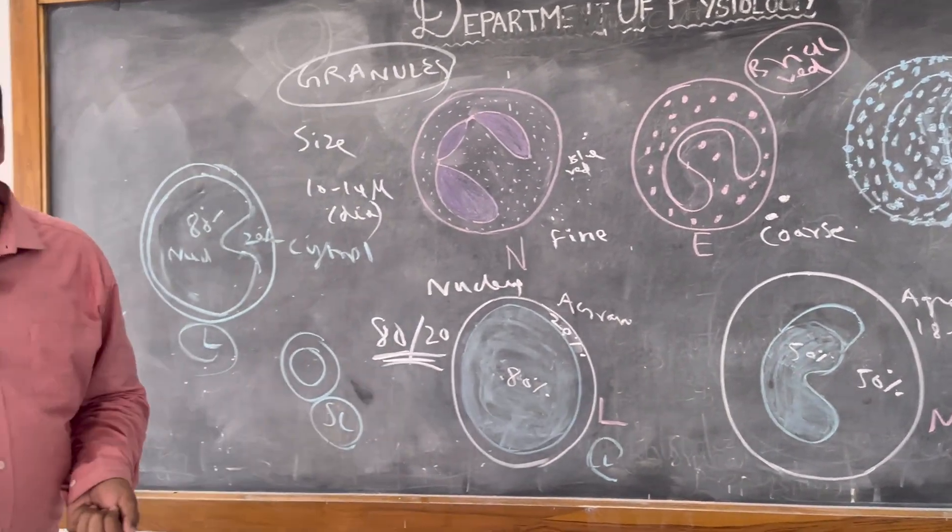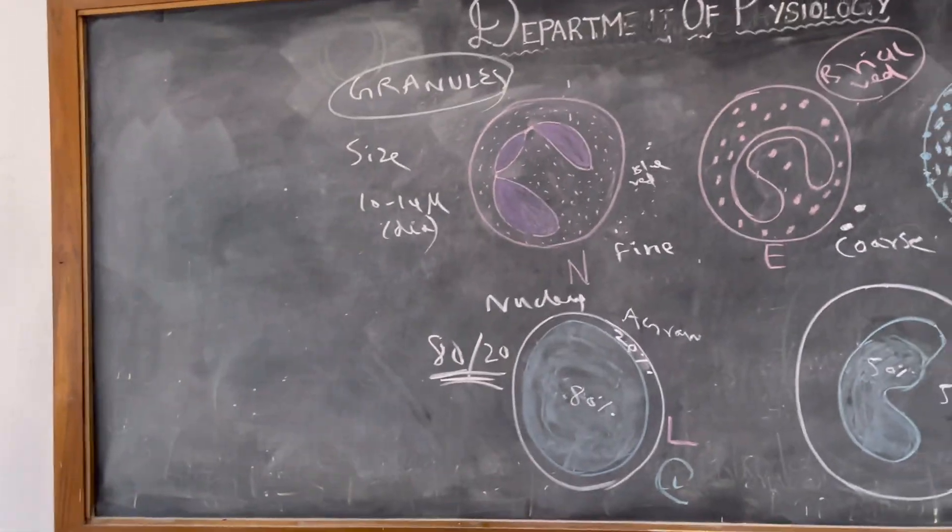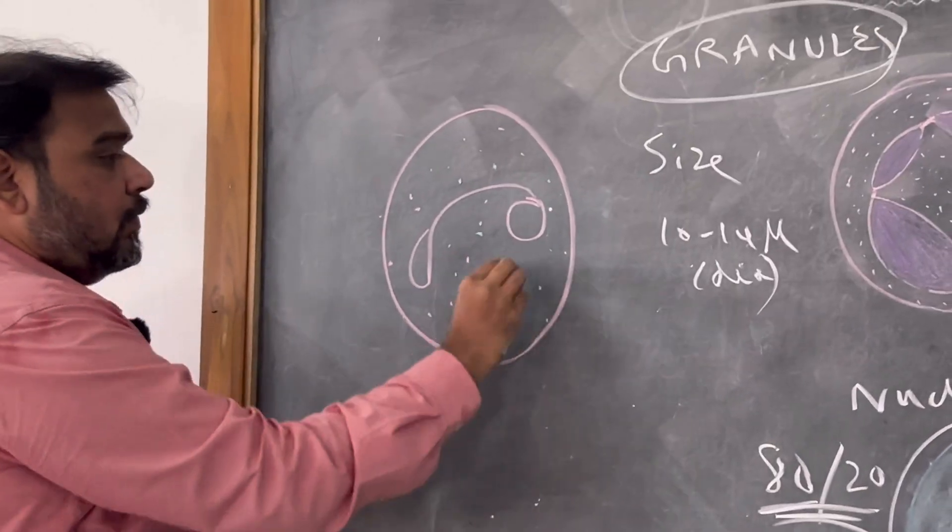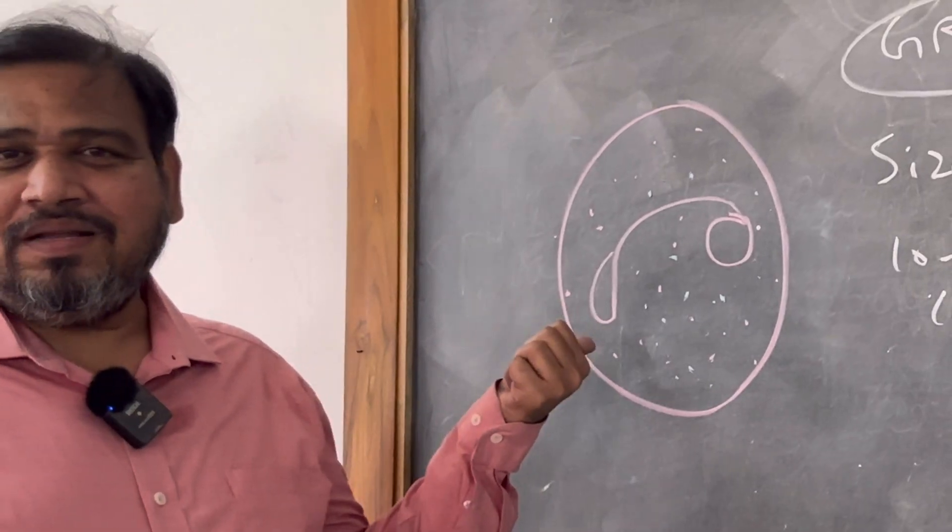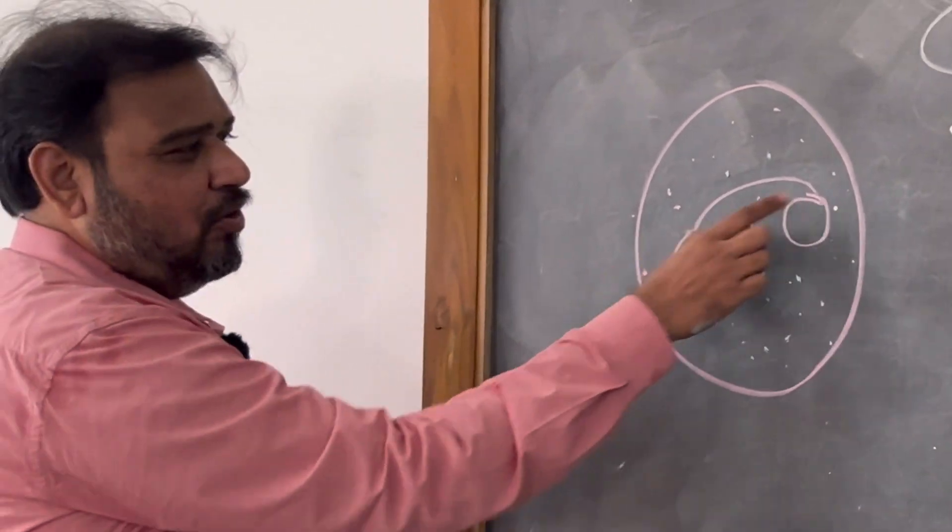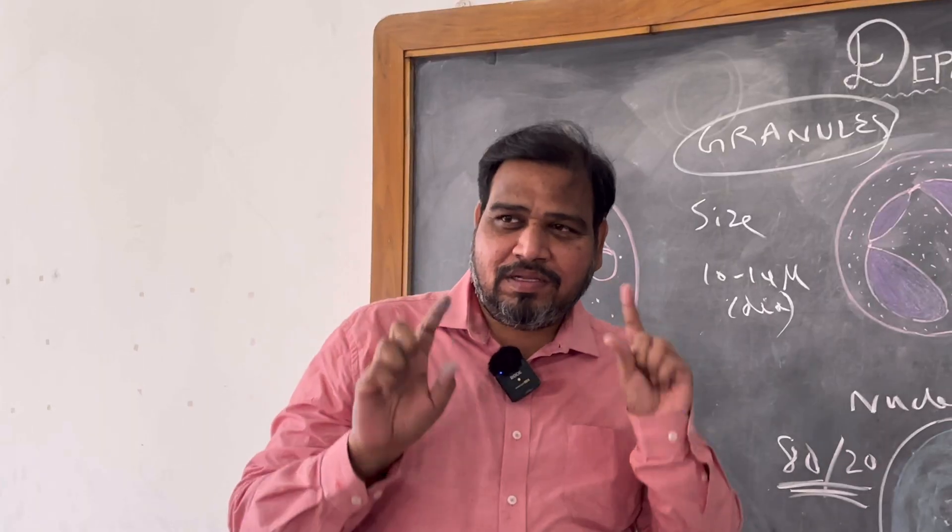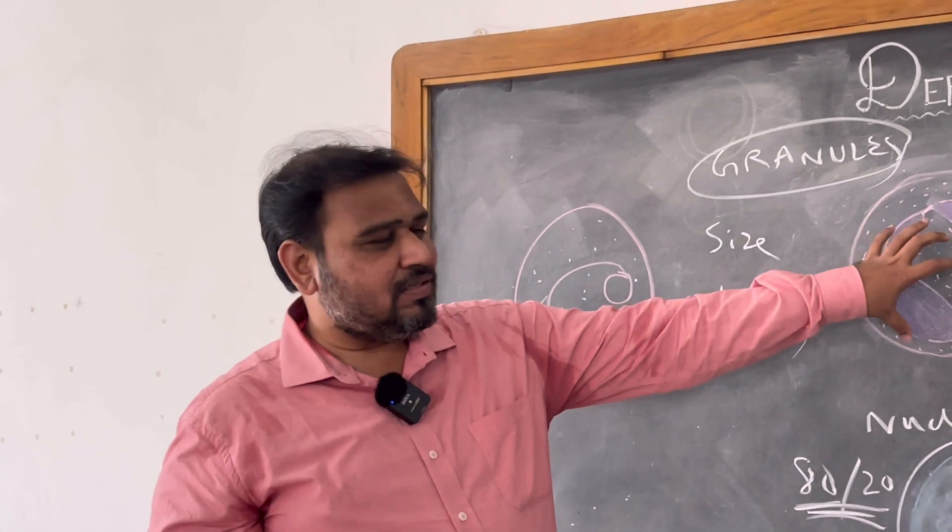Now coming to one more clarification. Now I will again ask you a question: when I ask what is this WBC, many will be telling eosinophil because it is like bilobed spectacle shape.